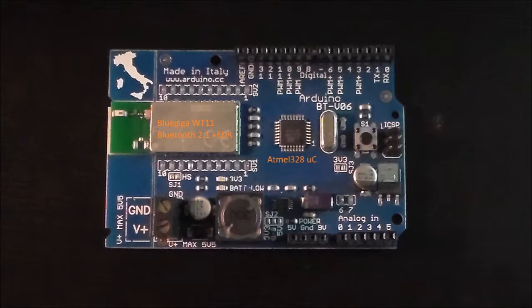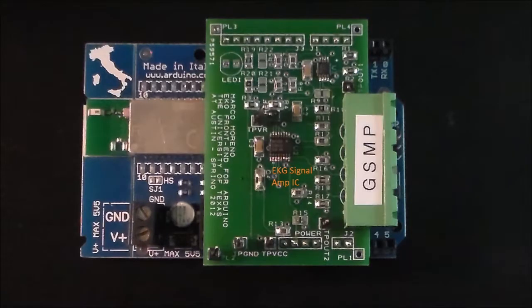The headers on the top and bottom allow external interfacing with the ADC converter input and other IO ports. Here we see the front-end board that I developed connected to the IO headers. It has an amplifier circuit for the EKG signal so that acquisition by the microprocessor's ADC converter has a good resolution. The EKG lead cable I constructed is connected between here and the body being observed.